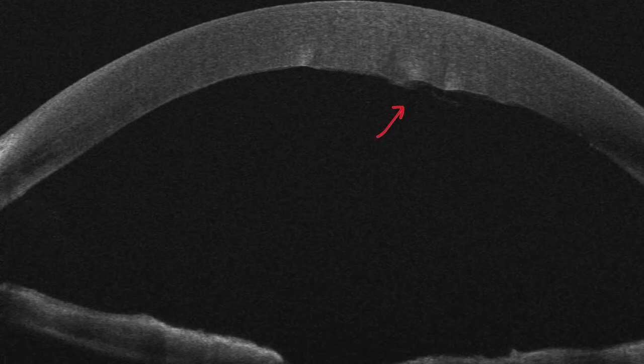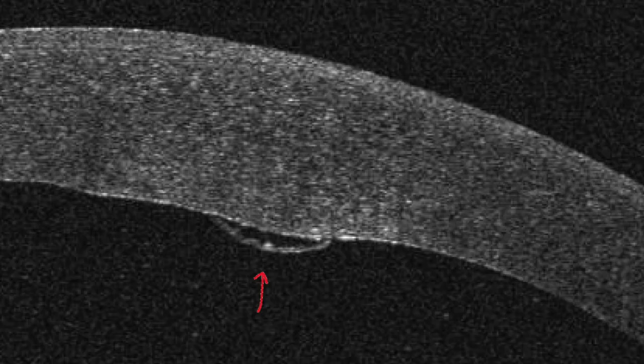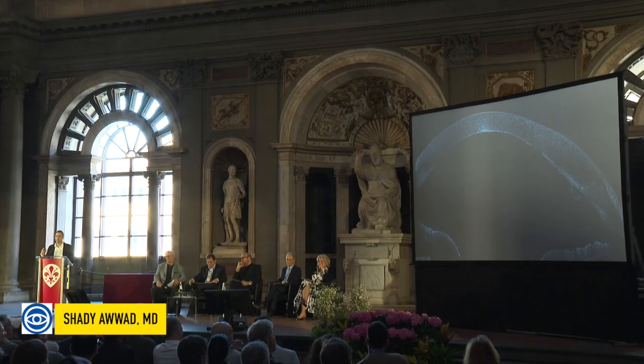Another example would be actually this. A patient was referred to me from a colleague, 3 days out, has a focal thickening in her cornea. And the technician just does the scan, which is an average scan, and you can't see much. But again, if you go ahead and perform a raw scan, you can easily see that there is an endothelial detachment, small endothelial detachment. And again, here, the same concept. Endothelium is such a thin layer, and if it gets averaged, it might very well get canceled, not summated, and you will miss these details.